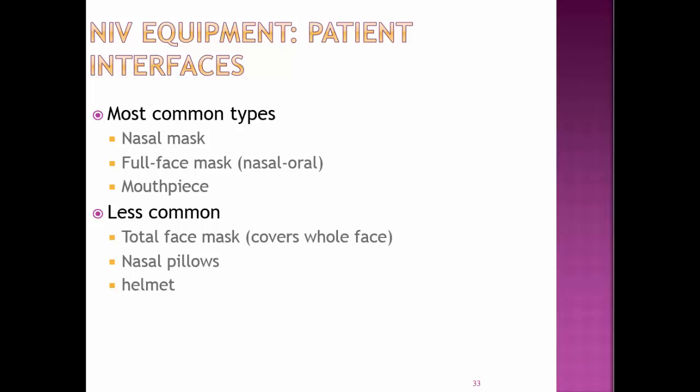The patient interfaces. The most common types are the nasal mask, the full face mask, or the mouthpiece. Less common is the total face mask, which covers the whole face, the nasal pillows, and the helmet.